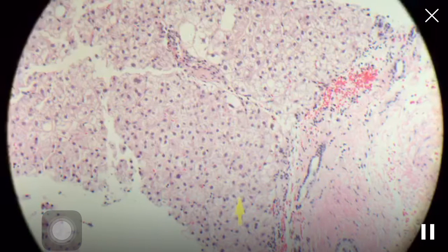So that begins to give an idea of how I write my reports. My diagnostic line for this kind of case is features of fatty liver disease, comma, question mark, alcoholic versus non-alcoholic, comma, with, and then I'll list the degree of steatosis, steatohepatitis, steatofibrosis. I always say alcoholic versus non-alcoholic, because unless I have a clear, really concrete clinical history, I can't be sure.